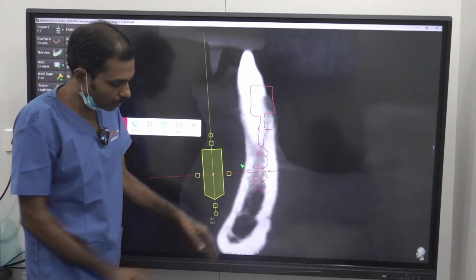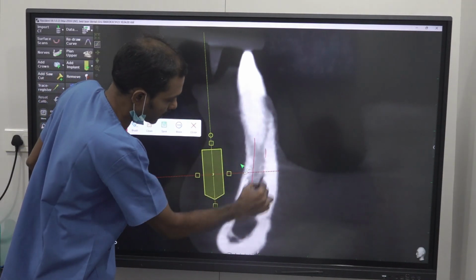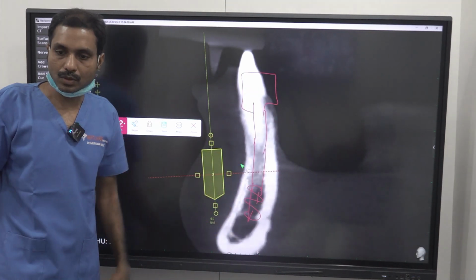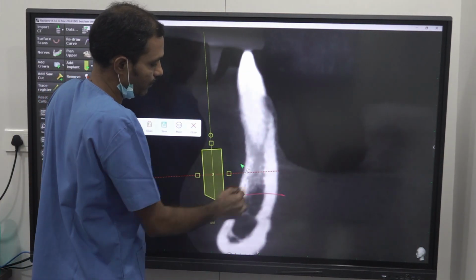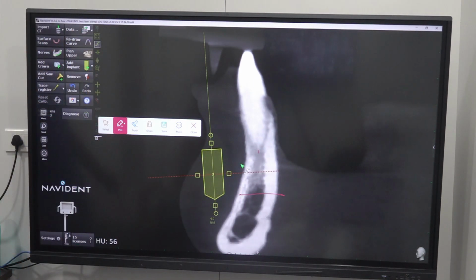If you insert too much, the implant will become loose. Okay. If you insert till here, the implant will lose its stability. So if you are using this, try to stop only till here. Okay. So both compressive and basal are good here. They will work.